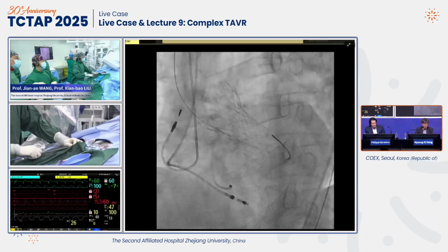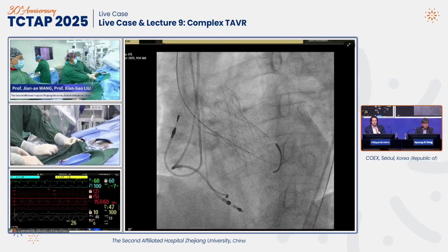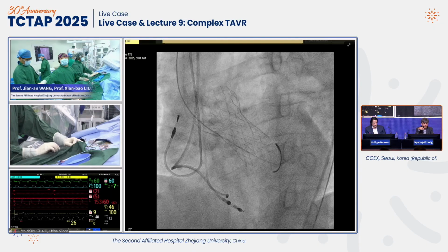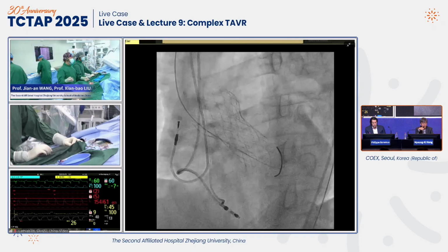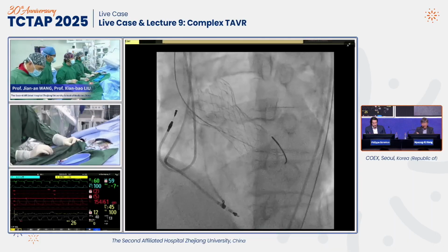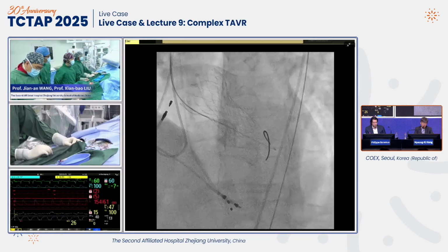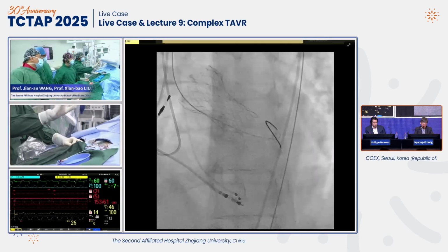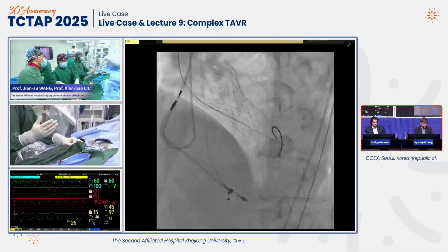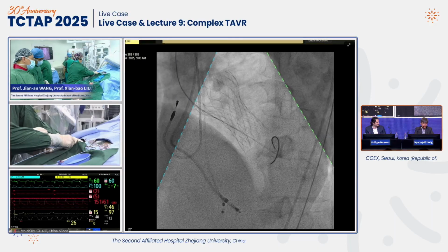So we have to decide whether we should post dilate or not. Bring the catheter over, we'll do one first. Please show the extreme RAO angle. In this view we can clearly discriminate the more and more extreme RAO. Wait a moment. Yes, almost more than that.